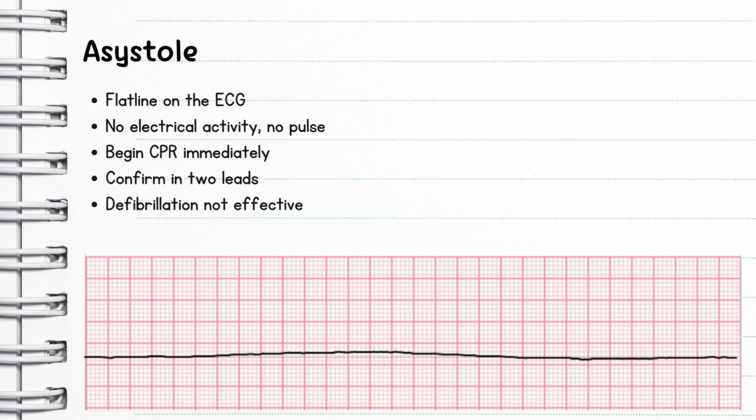But anyways, you're going to first confirm that it's truly asystole, and you're going to make sure the leads are in place. The other thing is asystole also might look like fine, very teeny tiny VFib. Okay, we just talked about VFib, and it may not actually be a straight line. It may just be teeny tiny little up and down VFib. So if it's fine VFib, you need to obviously go into the algorithm for VFib. You need to shock them or start CPR.